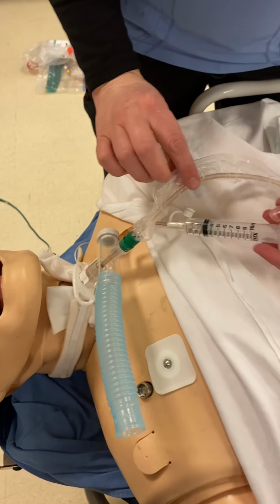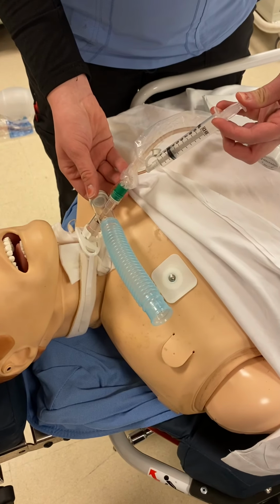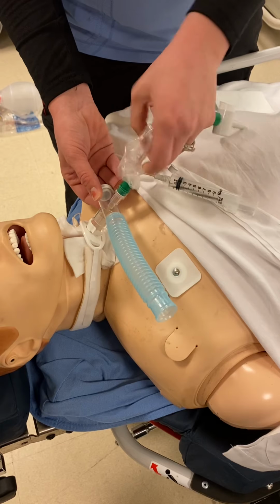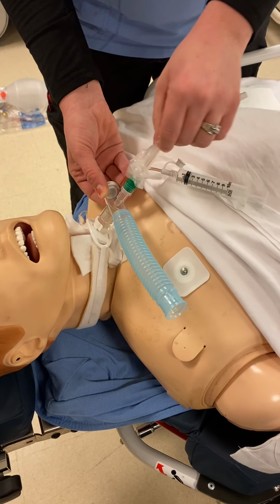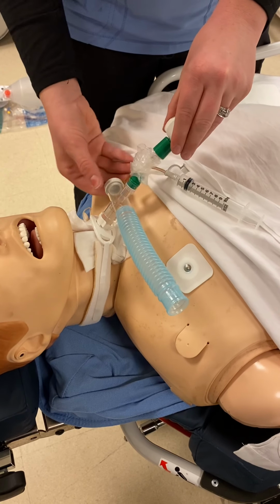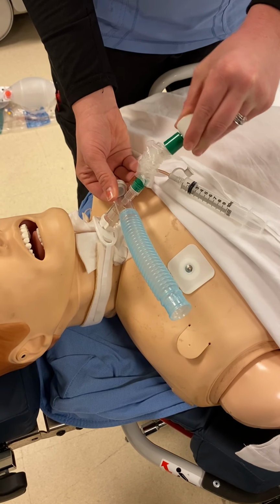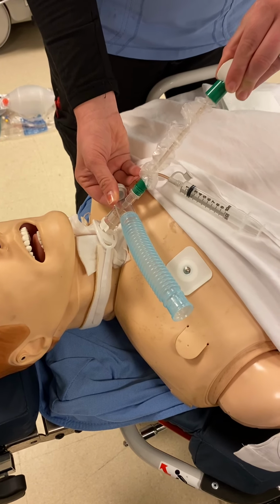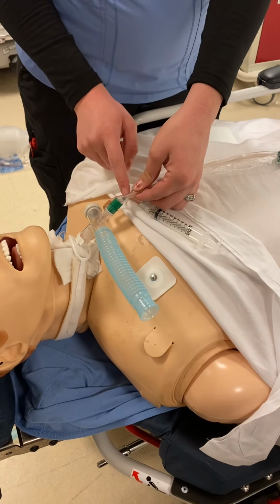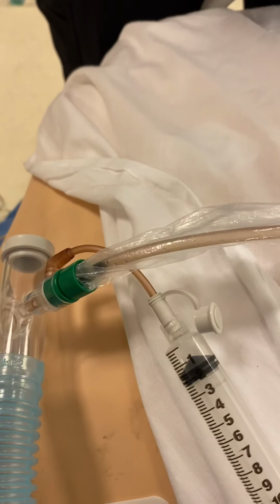If you're going to flush, you're just going to push in 1 to 2 cc's of volume. They're going to cough a little bit. You're going to continue to go down. Again, if it's getting stuck, you're going to twist until it goes down. You should almost touch green to green unless you're feeling a lot of resistance. You're going to push and hold as you draw back, keeping it under 10 seconds, and making sure that black line comes back when you suction.